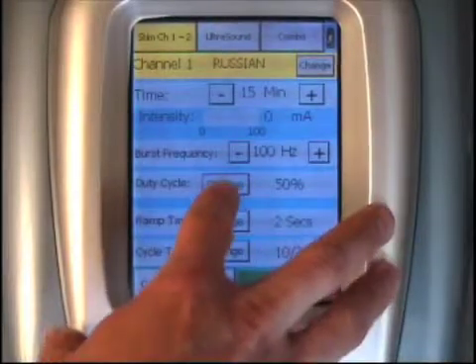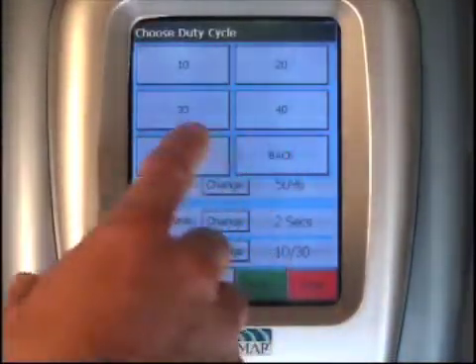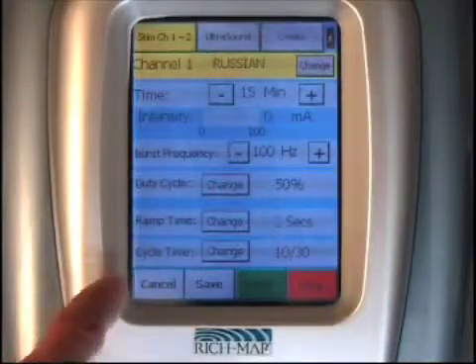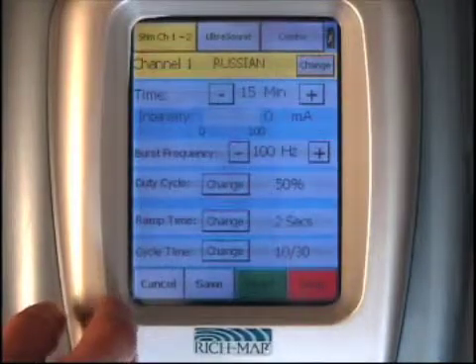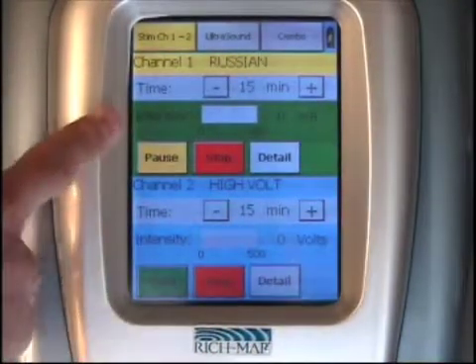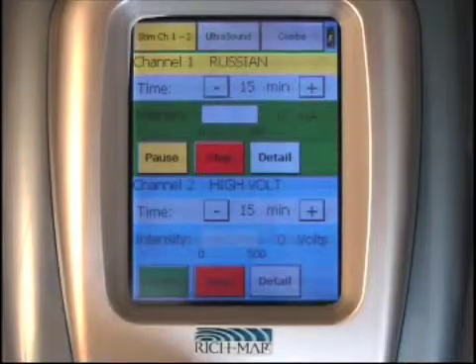You're able to select the detail button which controls all aspects and parameters of the stem for channel one. To change the duty cycle, you simply depress the change button and select the duty cycle of your choice. The ramp time and the cycle time follow the same sequence. Once those parameters are set, you select the start button at the bottom of the screen, which will illuminate the stem channel one with a green background indicating the unit is live and ready to go.